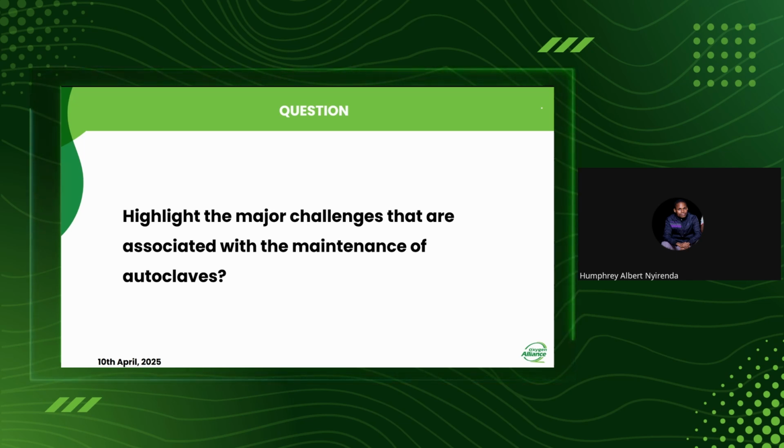So when this debris gets into the relief valve, it blocks those valves. It might be relief valves or other valves, but in her case, it's obviously the relief valve. It got blocked, and the pressure was just going up. The chamber is given a certain maximum pressure range, so in our case, the pressure went beyond the manufacturer's limit due to the faulty relief valves.